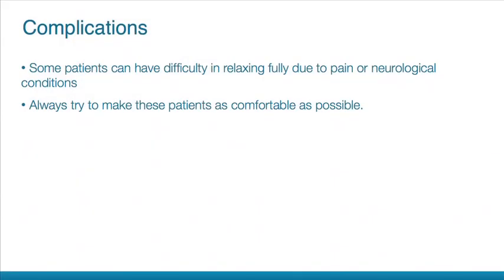Some patients cannot relax fully due to pain or neurological conditions. Try to make these patients as comfortable as possible.